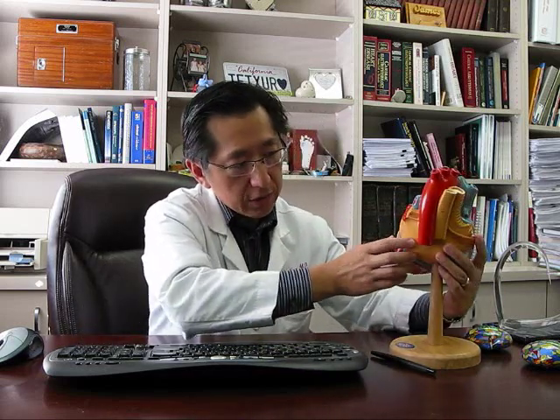The next thing we need to do is to perform something called a CAT scan or CT — specifically, a CAT scan CT angiogram. We then take that data and reconstruct the geometry of the heart, especially the left atrium.